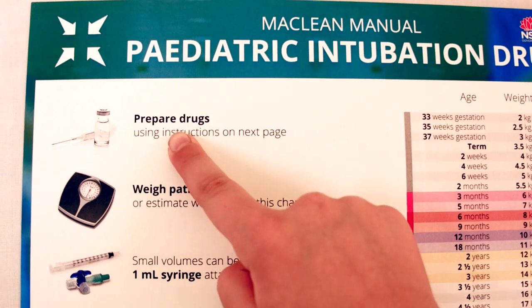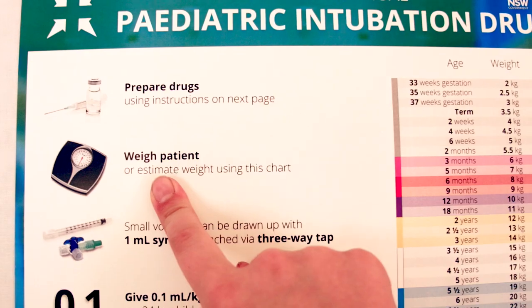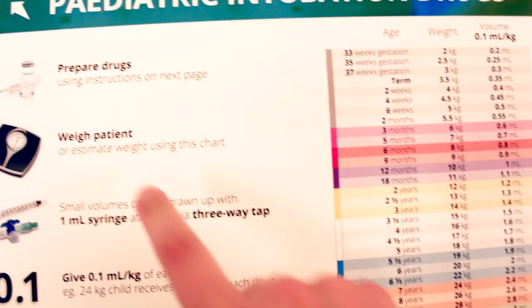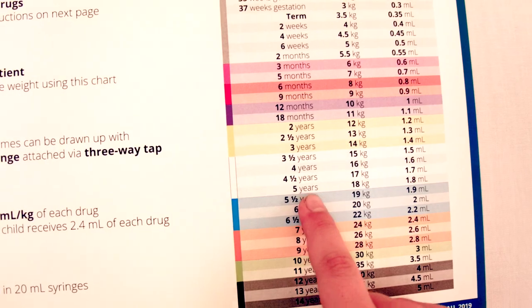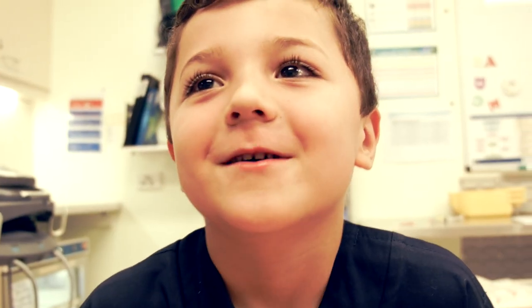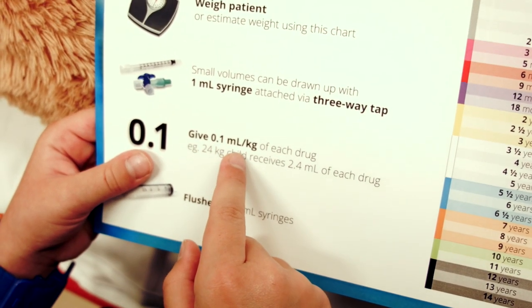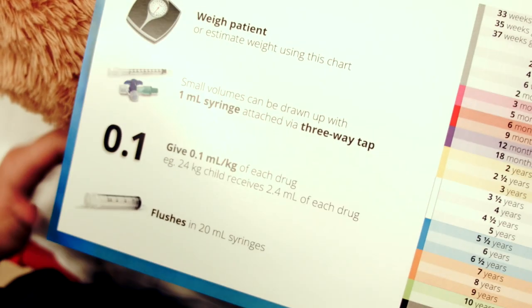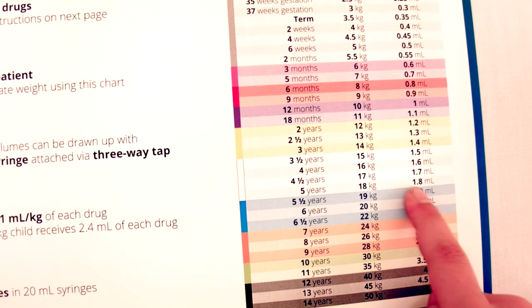Prepare drugs. Estimate weight: five years, 18 kilograms. Give 0.1 ml per kilo — 1.8 ml.